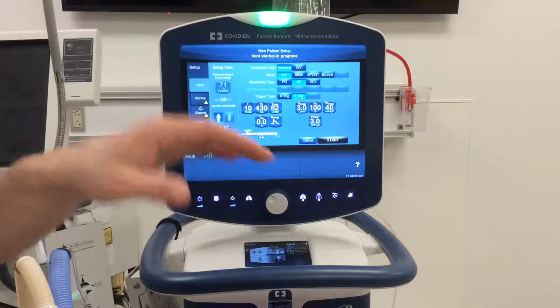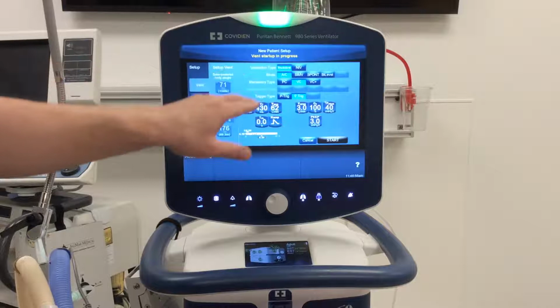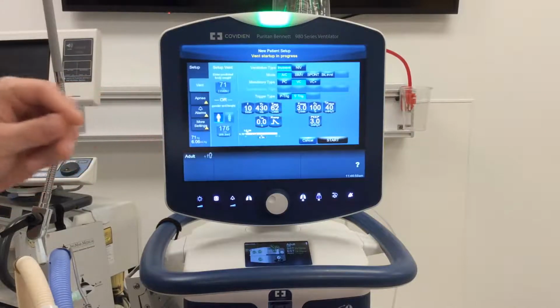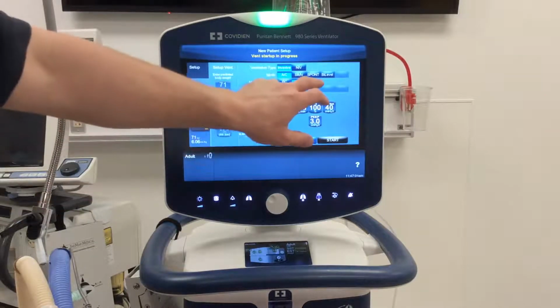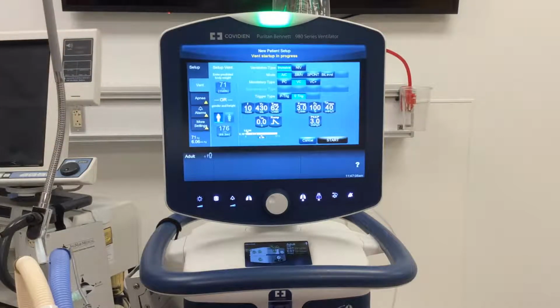So for our focus initially, until we really get some stuff down, we're going to be focusing primarily on pressure and volume ventilation as our control variables, okay? I do want to make note that there's something this ventilator calls VC+, volume control plus. It really is misleading because it is actually a pressure breath, but it has the ability to manipulate the amount of pressure up or down in order to get an appropriate size breath or achieve a target tidal volume that we tell the ventilator to do. Okay, so it's really kind of a hybrid if you want to think about it like that.